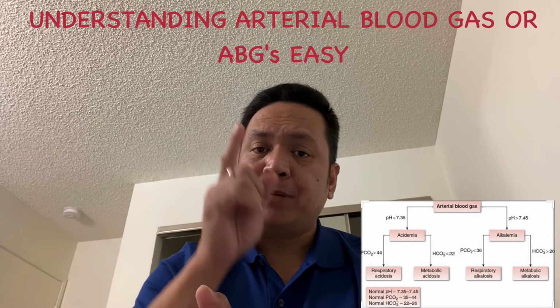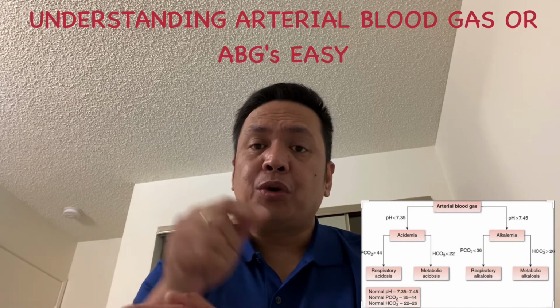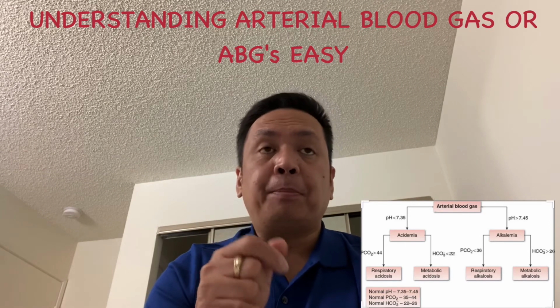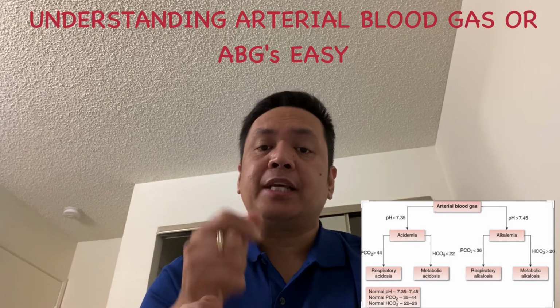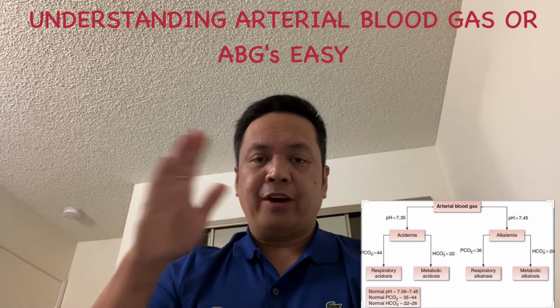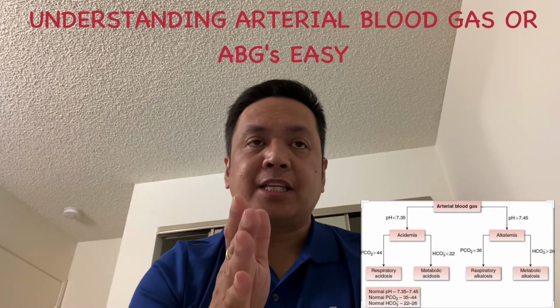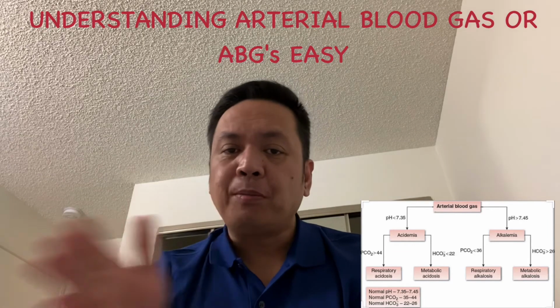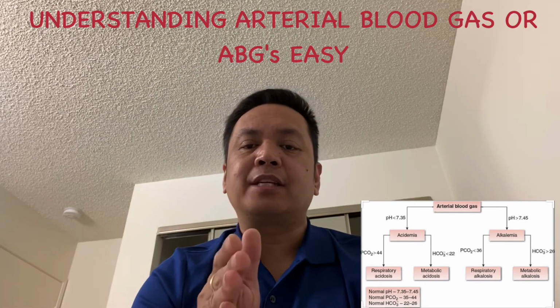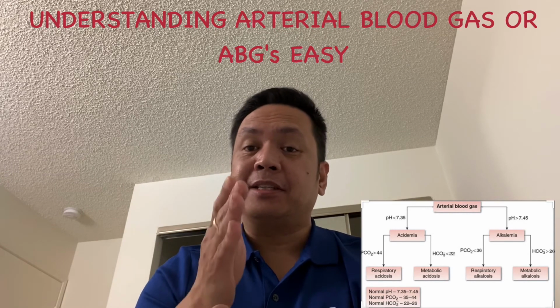If the pH is not within or close to the normal range, then a partial compensation exists. On the other hand, if the pH is back within the normal range, then a full compensation probably has occurred.